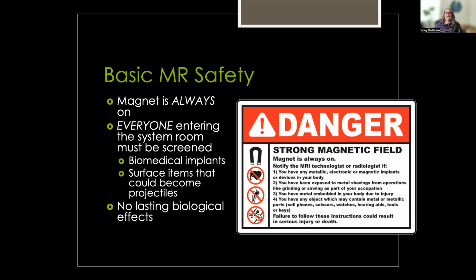So we'll do a medical screening, where we go through and get the history of the patient or the individual coming into the system room, their medical background, and then also a physical screening to see if there are any items that might become potential projectiles.